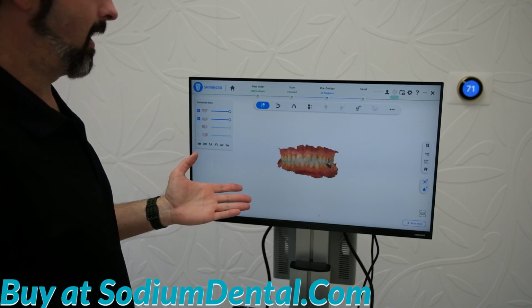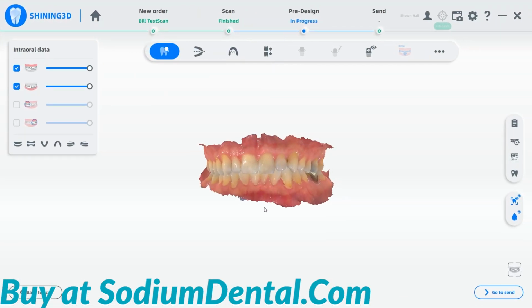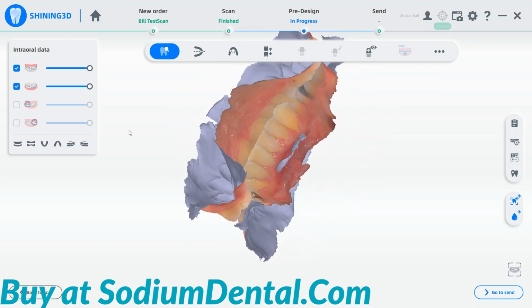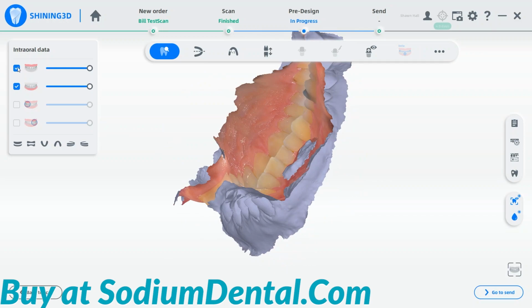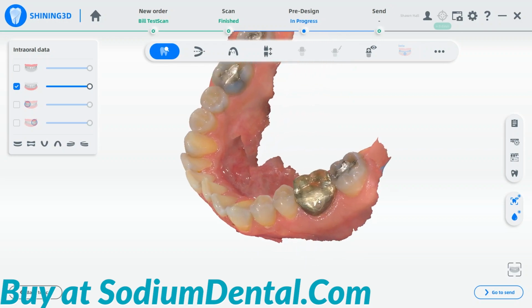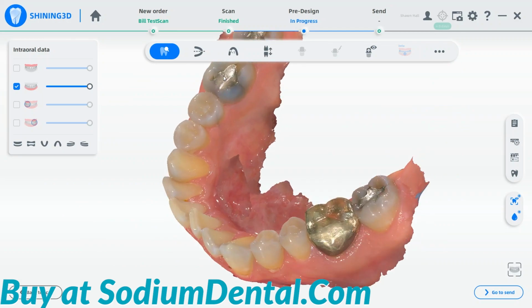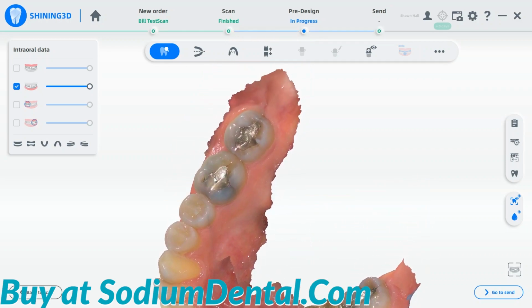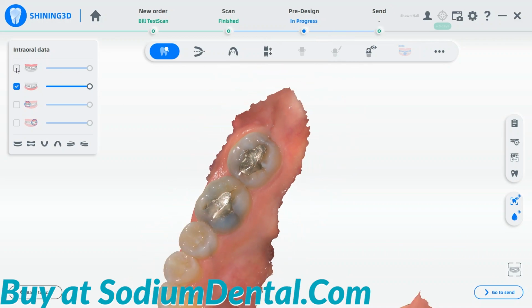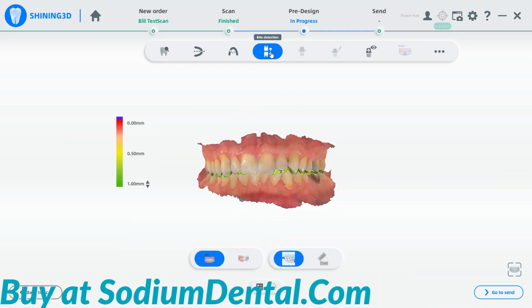Now you can see you have your high quality digital impression. From this screen, you can view the model. You can turn off models in the view to get a better view. Rolling forward with your wheel mouse will zoom in on the model. Holding both right and left mouse buttons together and pulling down will allow you to move the model around to get views. You can also see the bite detection from the model here.